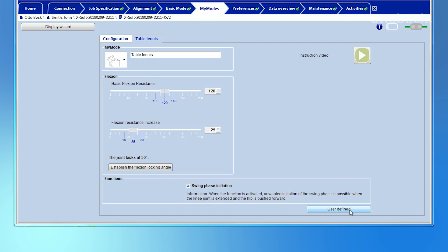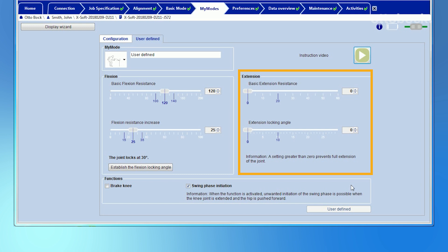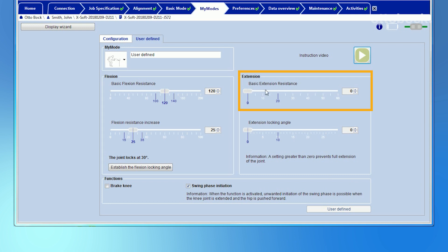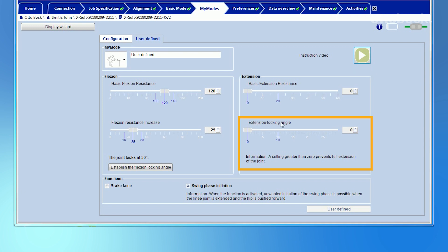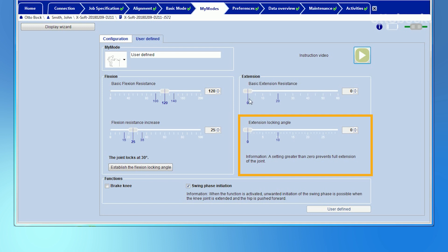Every My Mode can be individualized to a greater extent by clicking on the User Defined button. The extension behavior of every My Mode can be adjusted individually as required, but it differs from the flexion adjustment on the left side. Two values are available: the basic extension resistance and the extension locking angle.